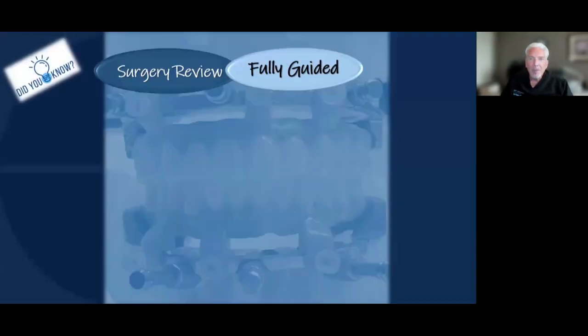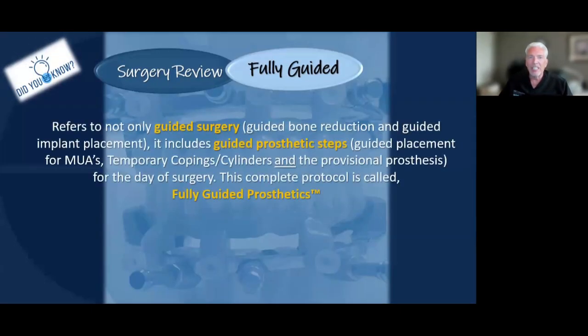Still talking about fully guided surgery. When we talk about fully guided, it's not only about the guided bone reduction and implant placement, but also about guided prosthetic steps. We're going to get more into that, where you're actually able to get your MUAs guided, and as we mentioned, the provisional as well.